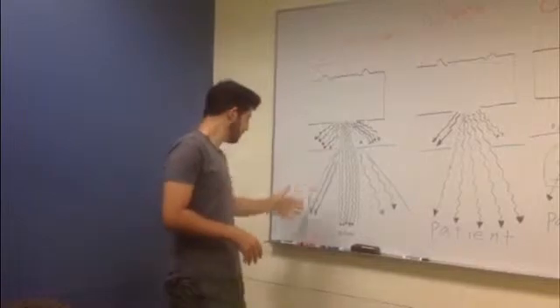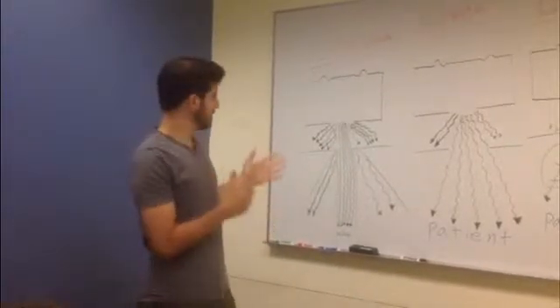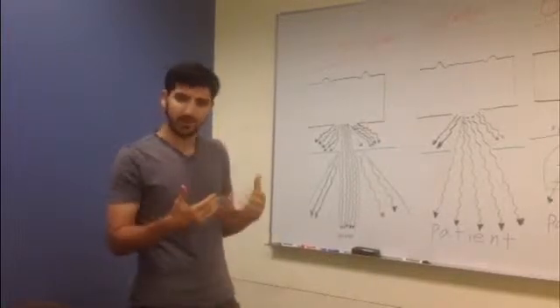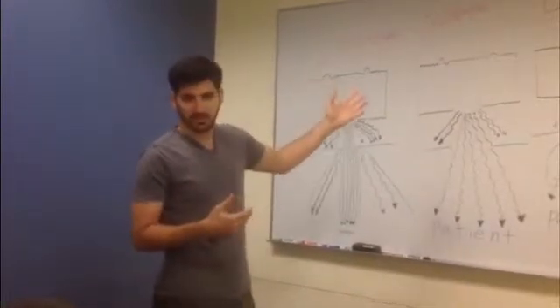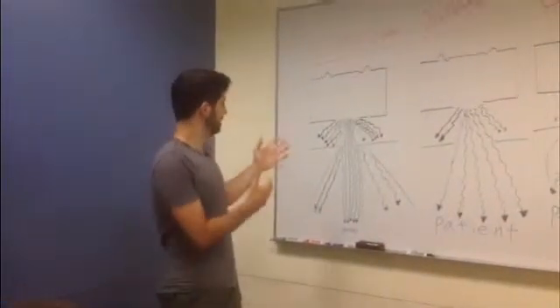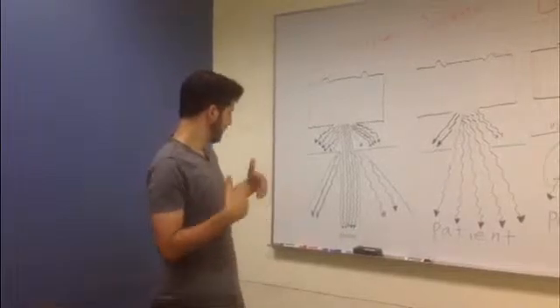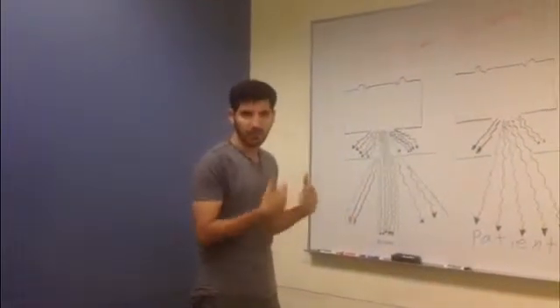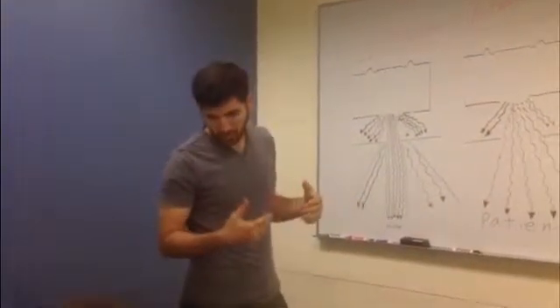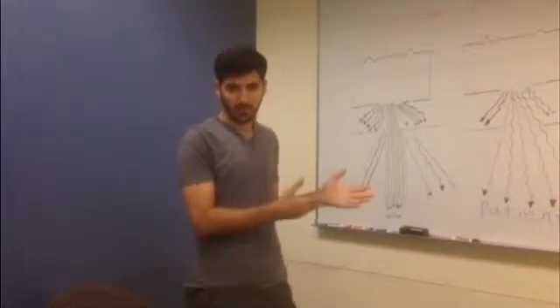The second type of beam restricting device is the cone or the cylinder. Here we see the cone, and here we see the cylinder. This type is a modification of the aperture diaphragm. However, there is a problem or a challenge with this beam restricting device, which is alignment, the alignment problem. Also, it is used mostly in dental radiography.